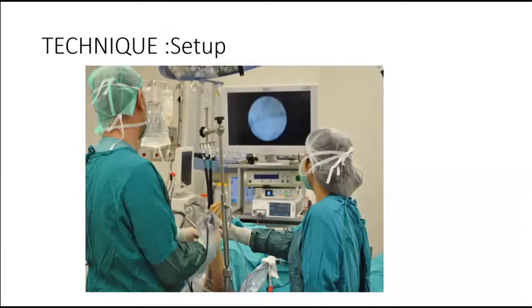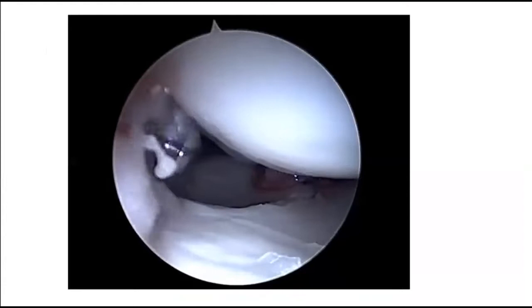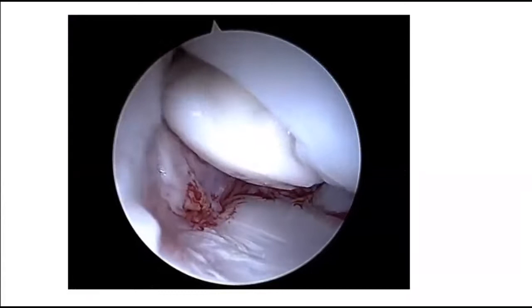The technique setup is very important. The arm is fixed on the table under tourniquet and placed in a traction tower. Synovial debridement is performed through the 3-4 portal with a shaver. The scapholunate ligament and capsule are debrided for preparation of the arthroscopic dorsal capsulodesis. Next, traction is released and the hand is placed on the operating table. The 3-4 portal incision is extended.